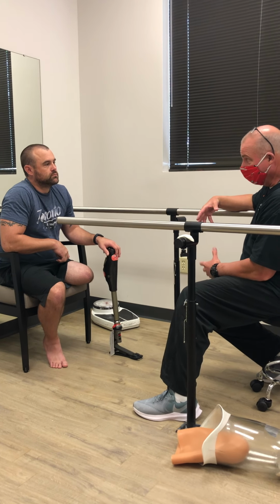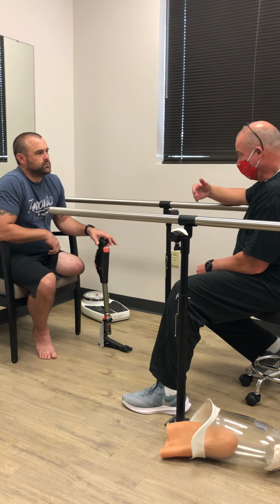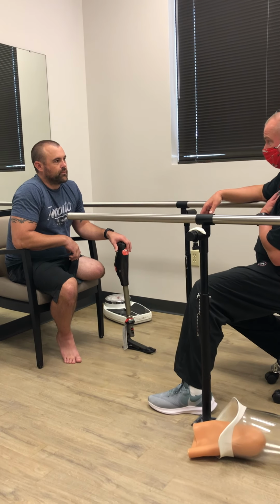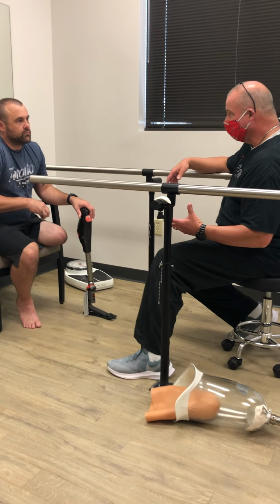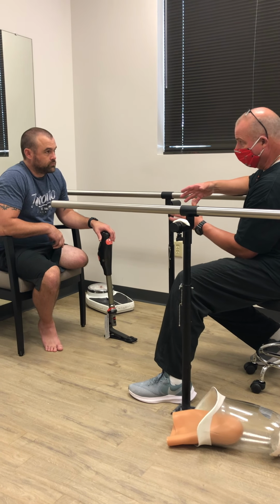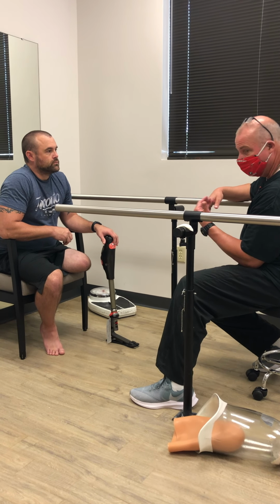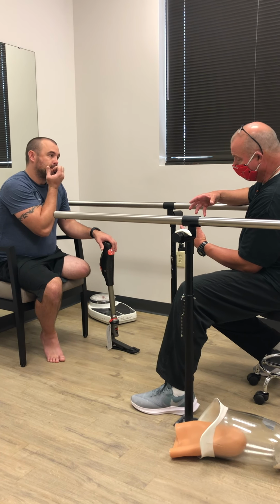After you get it for 3 months, yeah, you see, here's the thing, if you lose 5 pounds, that changes the fit. Not my fault that you lost 5 pounds. If you lose fluid, sometimes people get measured too early. And honestly, the practitioner probably should have had them wear the shrinker longer.